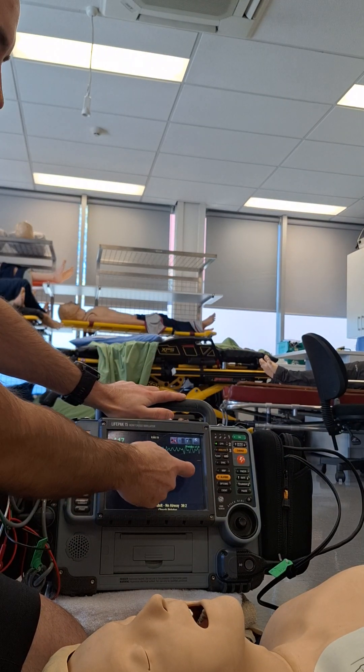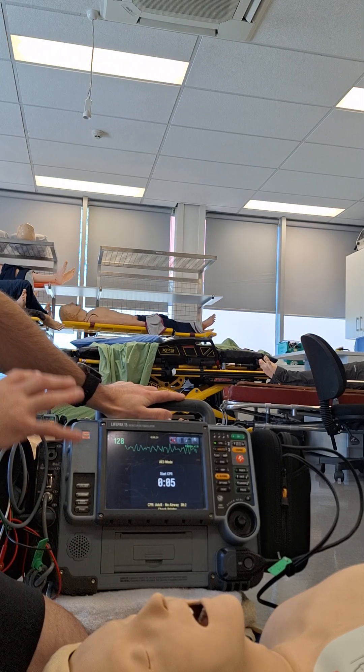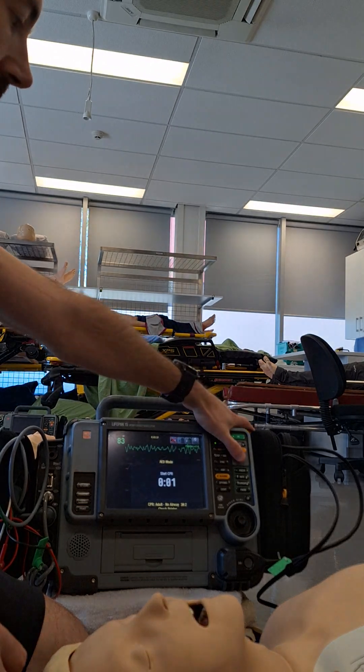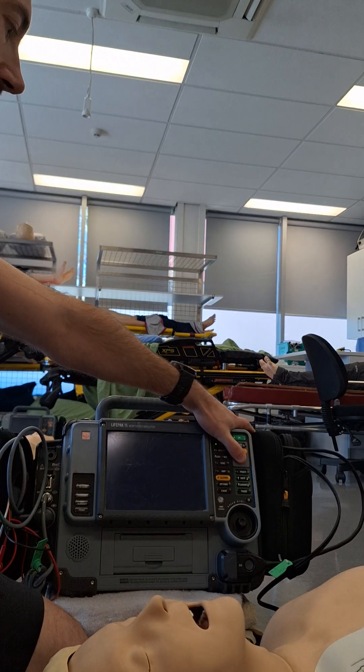Now we've got this short timer coming up. This is the monitor charging and getting ready to defibrillate. So I'm just keeping my focus on the monitor until we've actually done our defibrillation. So I've paused my compressor, I deliver the shock, and start them again.